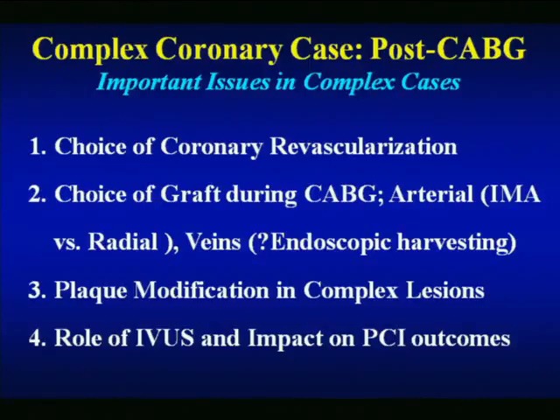And the plaque, there's no disease at the ostium of the left main, and it's confined to the distal part of the bifurcation. So my take on the case so far is this is exactly an advantageous role of the IVUS in helping you decide which lesion to address. This is not so straightforward, and some of the initial IVUS images were not clear, but the subsequent run was just fine, so we are quite convinced, and please proceed with it.